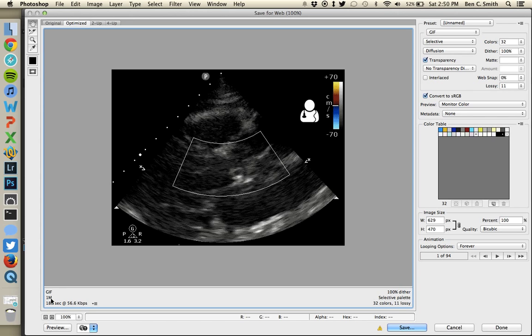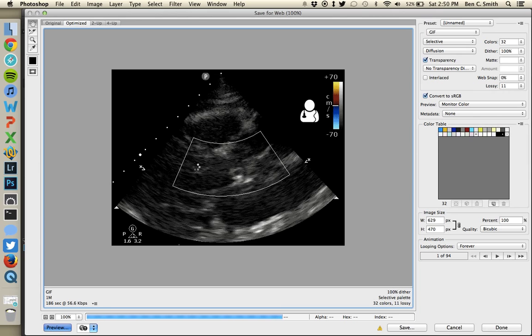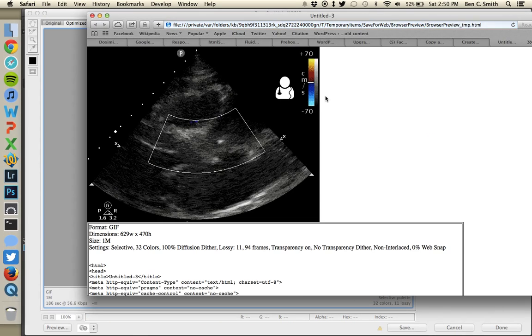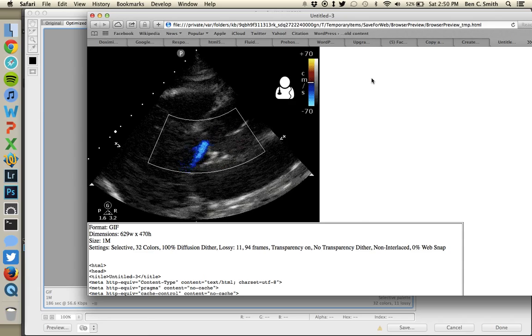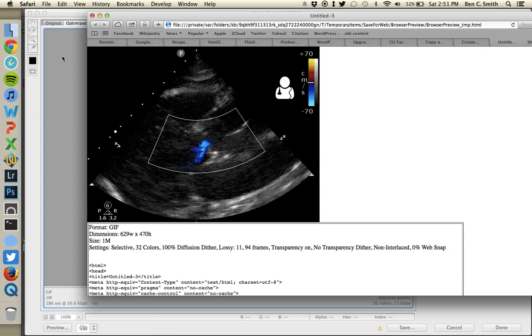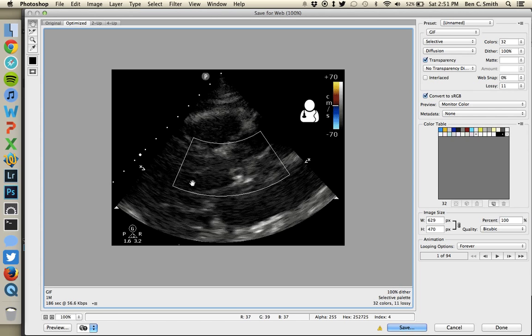Underneath the format selector is the current file size of your exported GIF given the options selected on the right. If you click Preview, it'll open in a web browser so you can see how it actually looks. Right now with default settings the quality looks really grainy — almost useless. The good news is I have room to work with: one megabyte is a pretty small GIF, and Twitter allows up to two megabytes. So I can start modifying the options on the right to improve image quality.